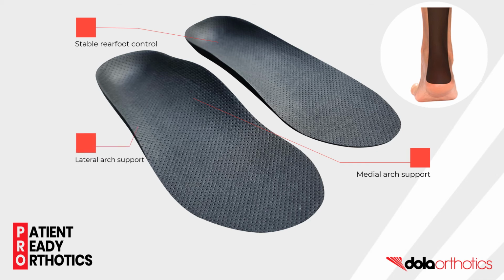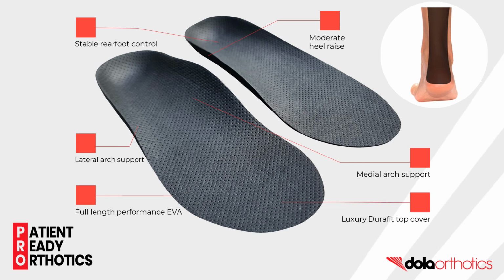The lateral arch support stabilizes the foot and aids in the transition from heel strike to toe-off. A moderate heel raise reduces tissue stress on posterior structures and improves sagittal plane transition from mid-stance to propulsion and addresses any ankle equinus. The full-length performance EVA shell provides the combination of cushioning and control needed by this foot, and the luxury DuraFit top cover is designed for both daily and sporting activities.